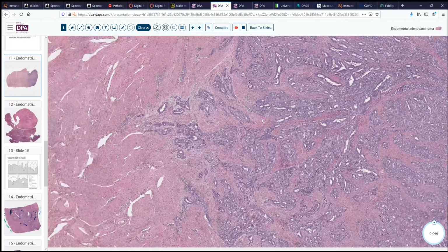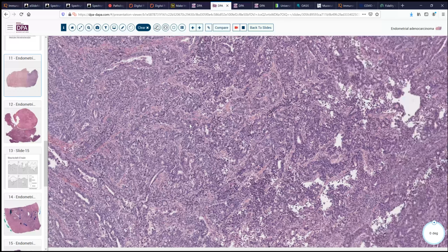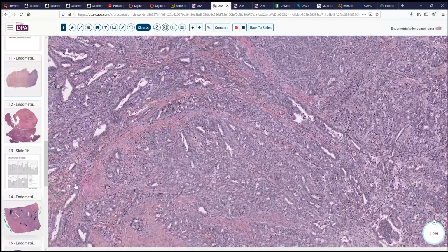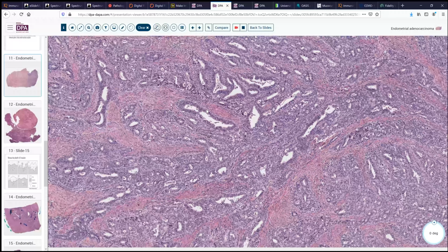Now, what does one do if you have, say, grade 3 tumor up near the surface and mostly solid growth in an area like this versus maybe your infiltrative component is composed of more glandular tissue like this? And there's no criteria for making the distinction in that situation. There's no grading of different portions or percentage grading that is allowed. You're to take the overall appearance and grade on that basis.